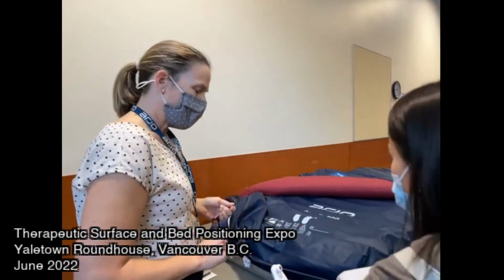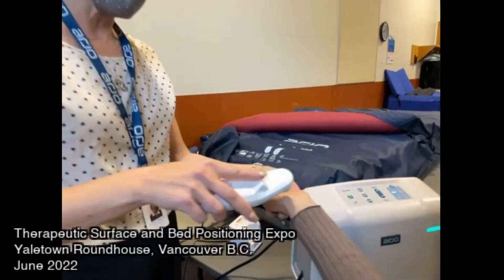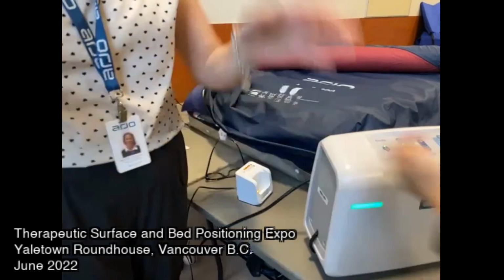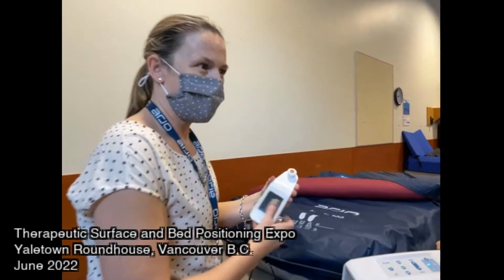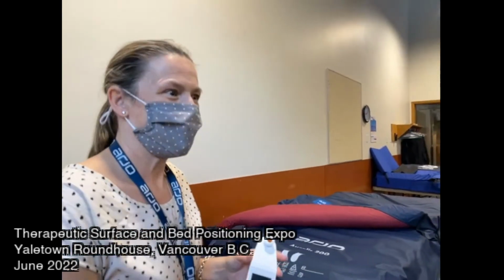Oh, so just hold it? Yep, take the machine, and let's pretend that's your heel. You go like that, and that way. It's 6 measurements. It's just those 2 bony prominences, heel and sacrum. Yes, that's right.